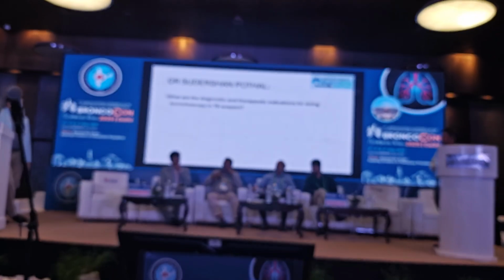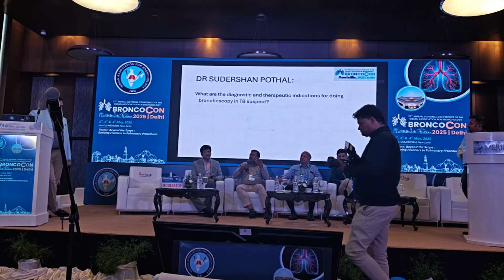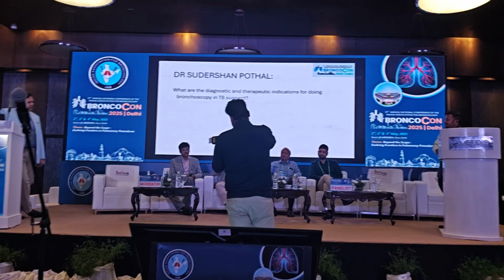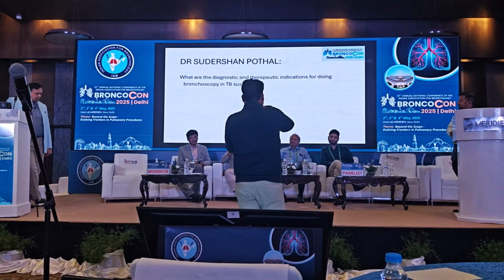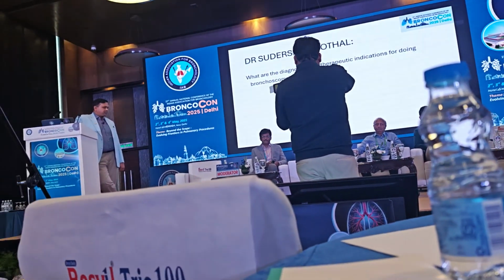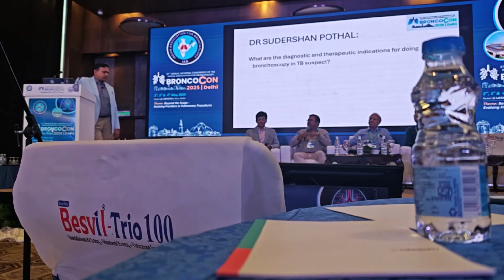Simultaneously, with regard to the therapeutic concern, we are used to doing more of the rigid. It could be due to severe hemorrhage, or due to some stenosis or obstruction, or it could be due to treatment of some fistula, bronchial fistula, and so on. These are all indications for both flexible as well as rigid.